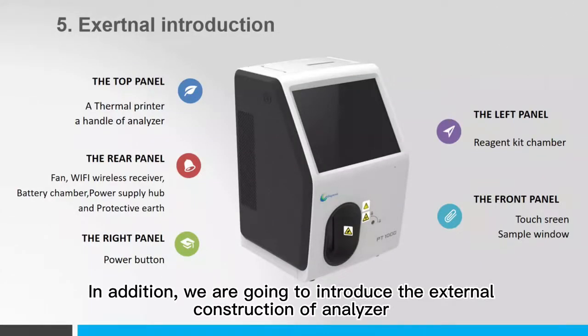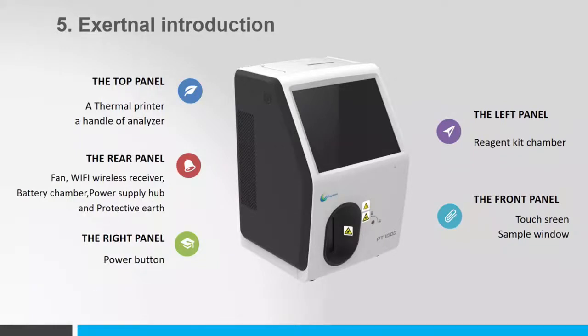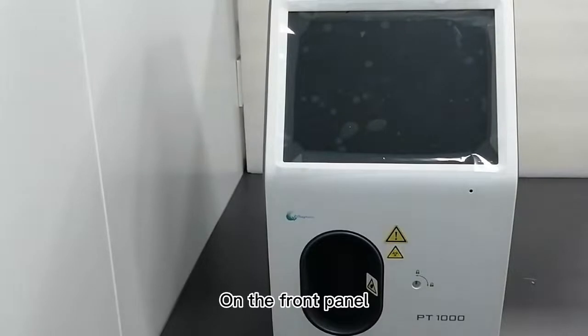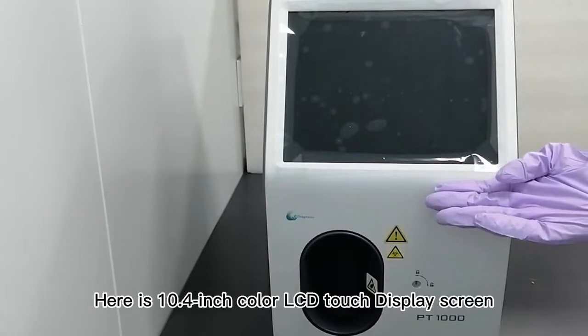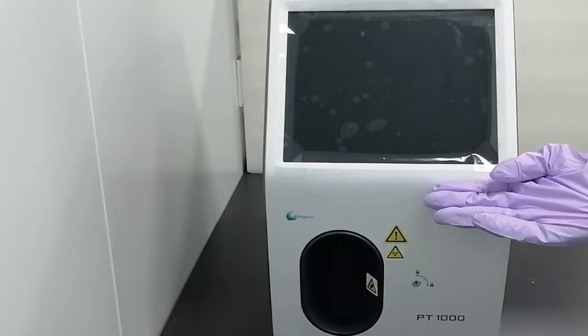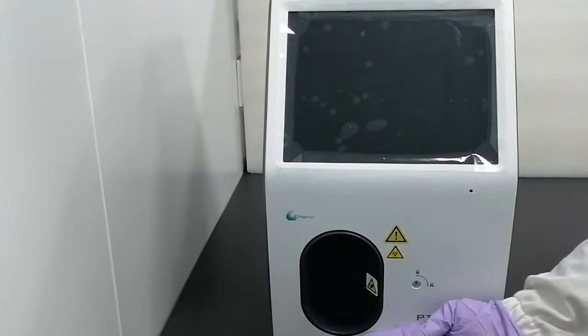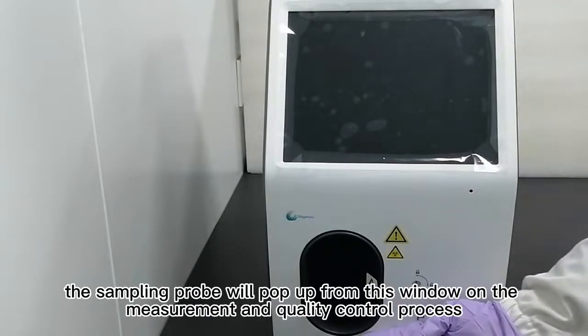In addition, we are going to introduce the external construction of the Analyzer and the matter of carrying the Blood Gas Analyzer carefully. On the front panel, there is a 10.4-inch color LCD touch display screen with a resolution of 1024×768. Below is the sample window — the sampling probe will pop up from this window during the measurement and quality control process.